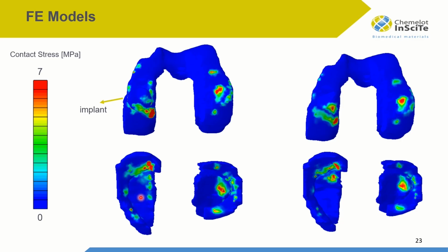And if you check the stress intensities in the tibial cartilage, we see that the tibial cartilage is loaded less in the implanted version. But I must also tell you that these differences are less than 10%. So this may suggest that the implant position is acceptable.